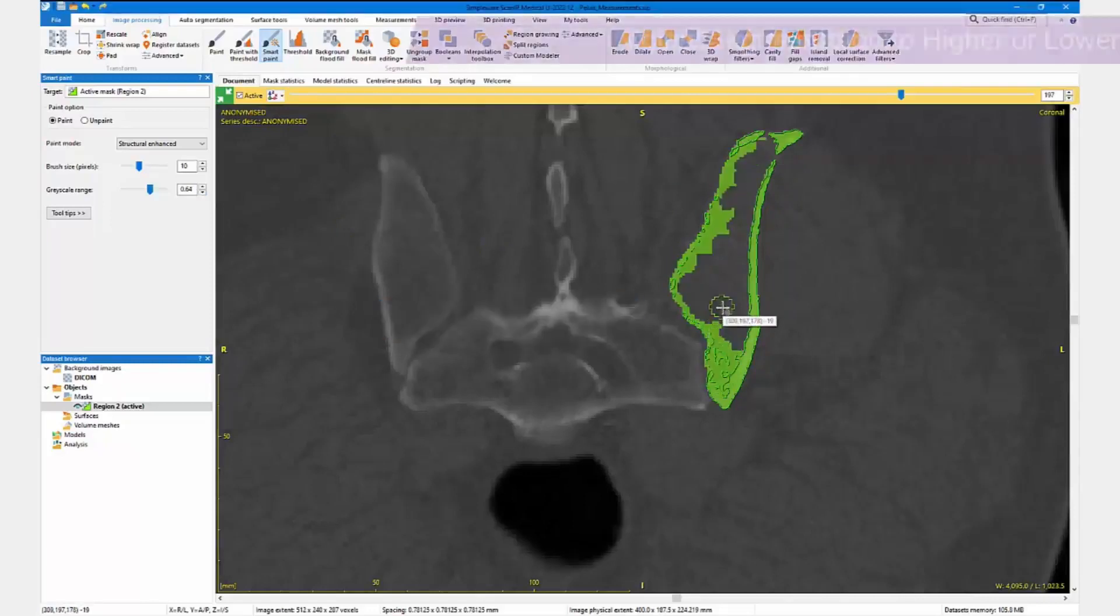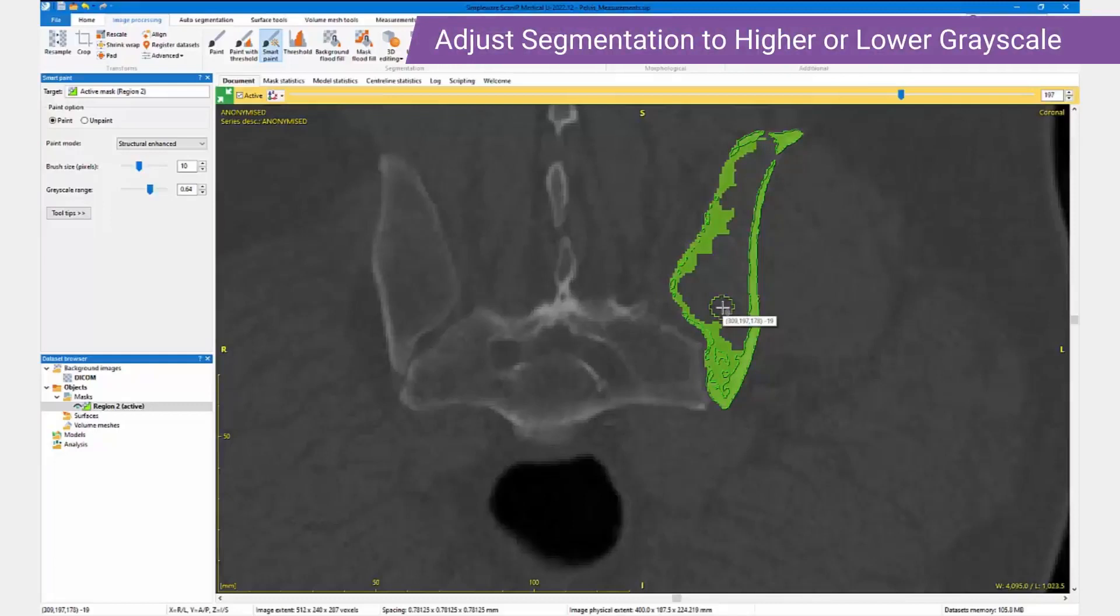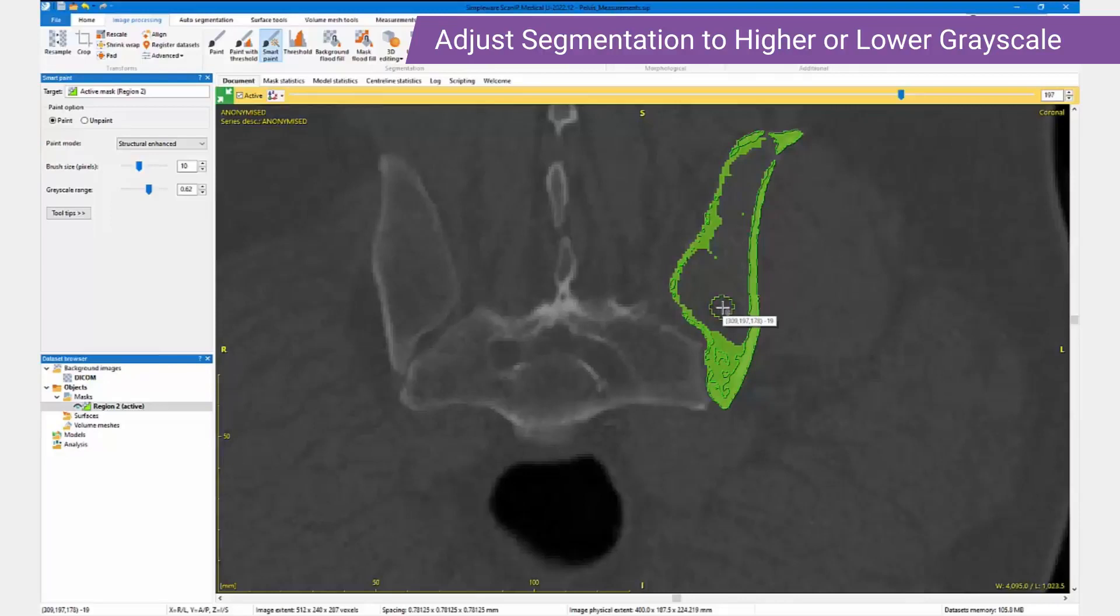After each paint operation, we can nudge the segmentation to a higher or lower grayscale range to adjust the segmentation to our needs.